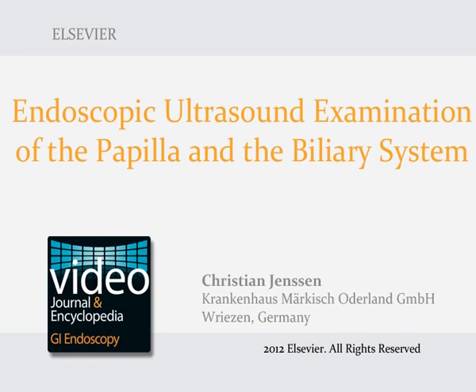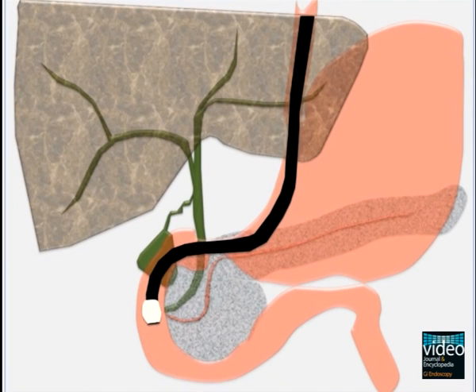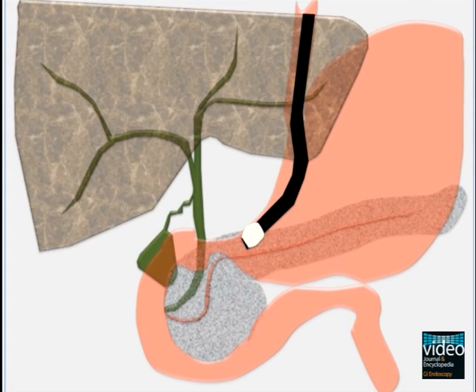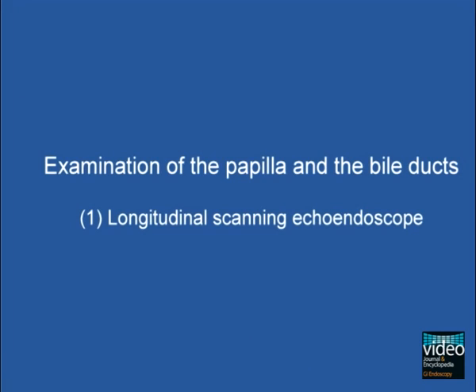The video describes the endosonographic examination of the papilla and the biliary system. Basically, there are three positions to evaluate the biliary system: one, a position at the level of the papilla; two, a position at the apex of the duodenal bulb; and three, a gastral position with the transducer in close contact to the smaller curvature.